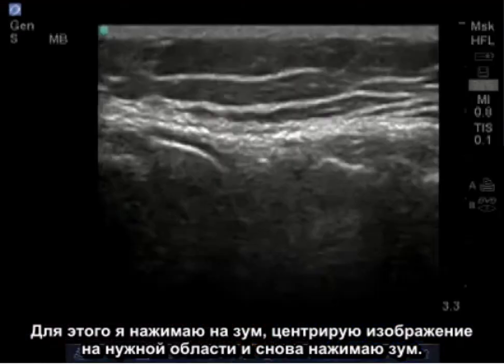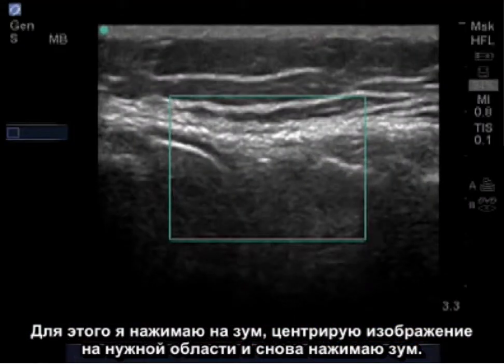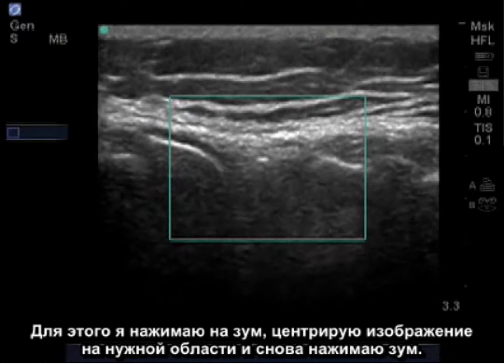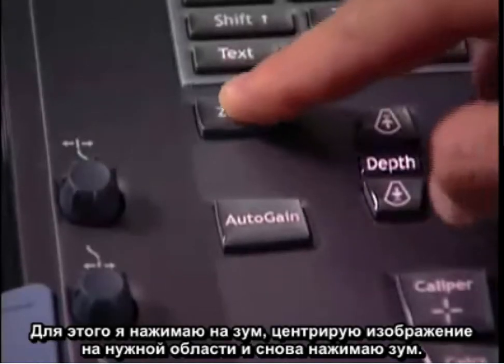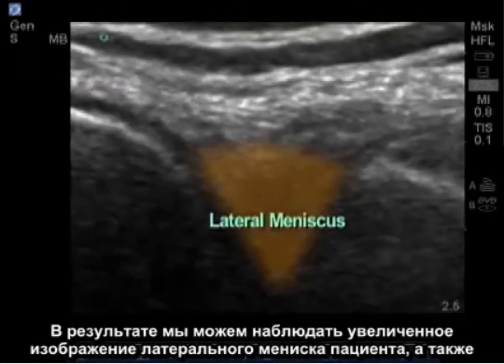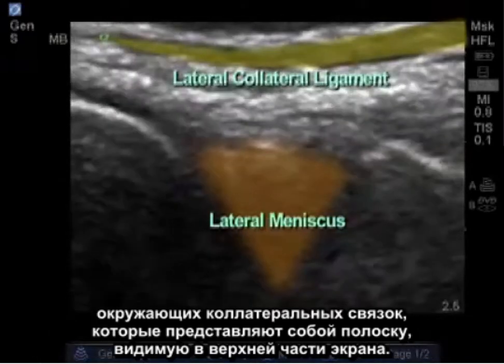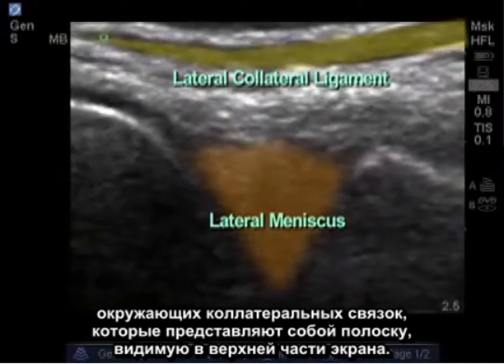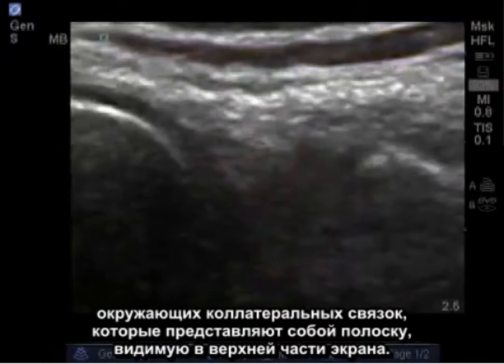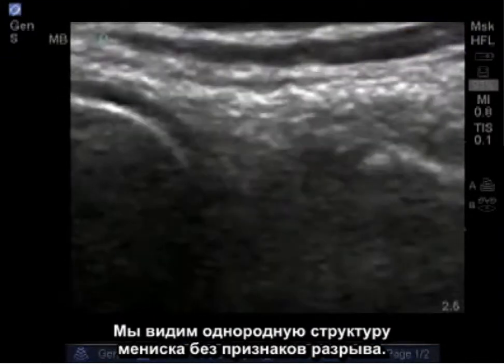An additional feature that we may be able to use is to zoom in on a structure. To do this, I'll press zoom, center over the desired region, and press zoom again. Now I have a blown-up image of the patient's lateral meniscus, as well as the surrounding lateral collateral ligament, which is a band seen at the top of the screen. Again, seeing a homogenous image of the meniscus with no indication of tearing.